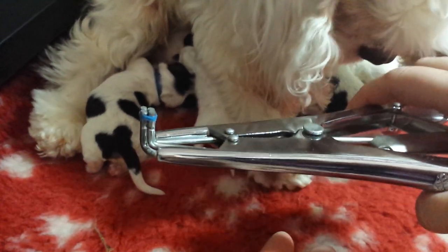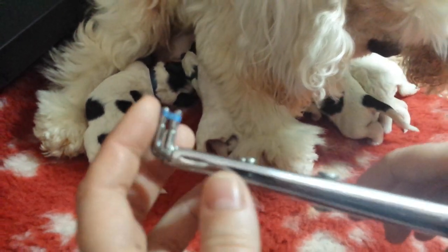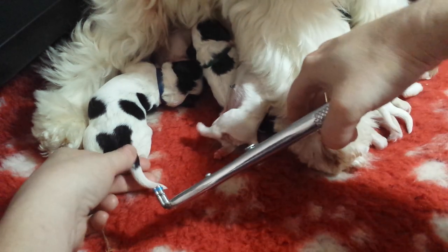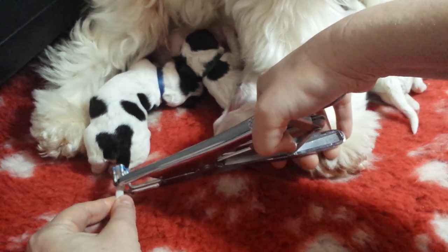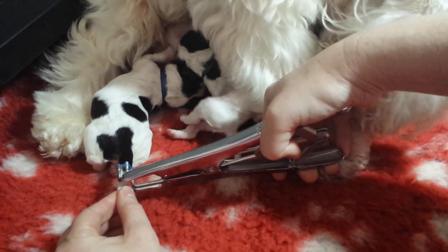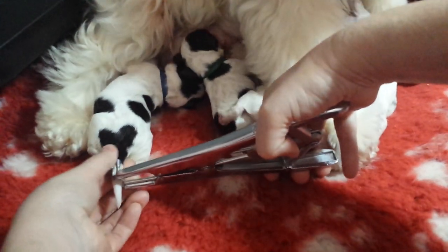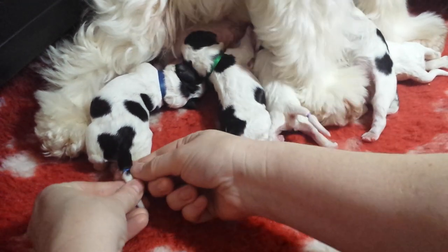I have my little band clear to the end. You're going to want to set this metal band — the tail will slide up inside of it. Set this elastrator directly behind where you want your rubber band to be placed on the tail. I'm going to start with Blue Boy here. So you hold your tail out, slide your elastrator up on the tail, figure out where you want to dock at. Gently close the elastrator, slide your band off. As you notice, puppy didn't flinch — no crying, no tears, no issue at all.